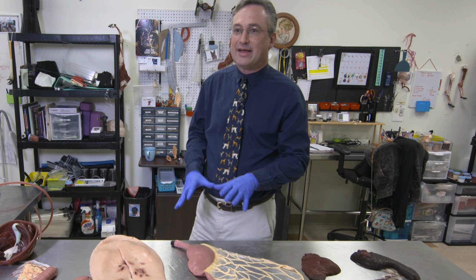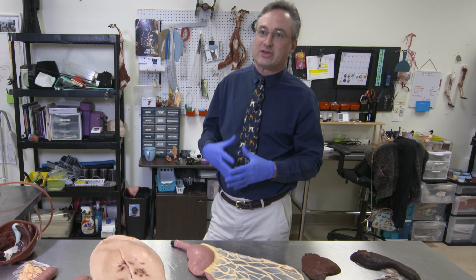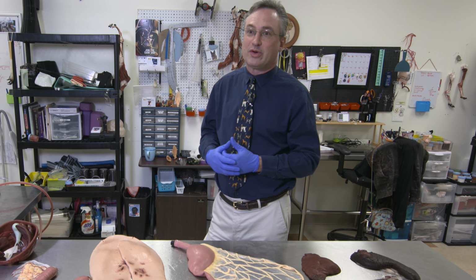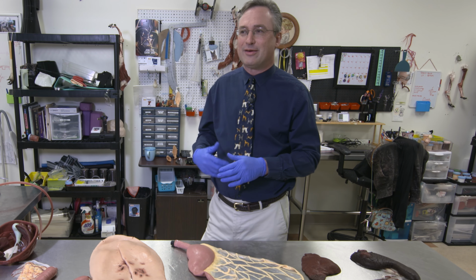is corrected. Again, this is a type of pathology that I want every student to become comfortable with, to experience, so that when they do see it in the real world, and they will, they already know what to do. They already know how to save that dog. And even those who are familiar with and have seen these before, this could allow you to hone your craft.